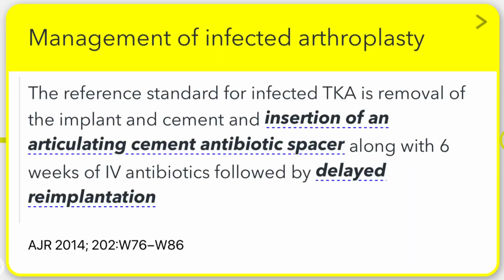Removal of the implant and cement. Insertion of an articulating cement antibiotic spacer. Administration of 6 weeks of intravenous antibiotics. Delayed reimplantation of the prosthesis.